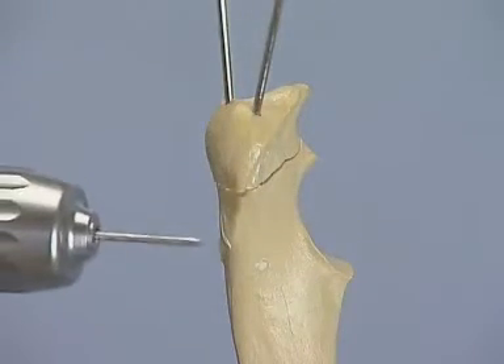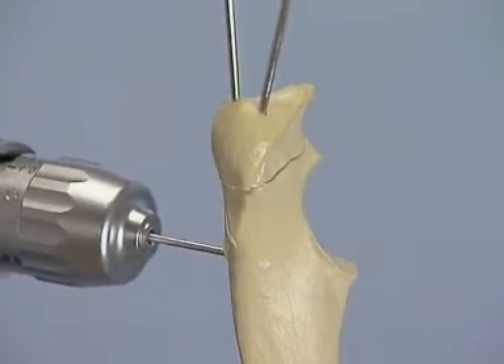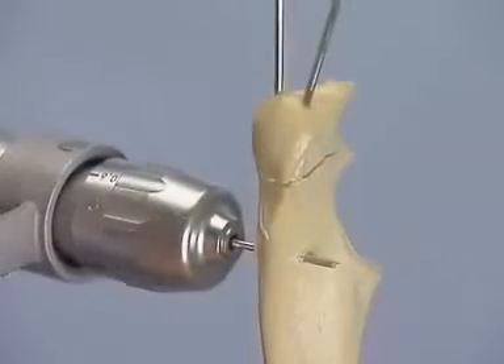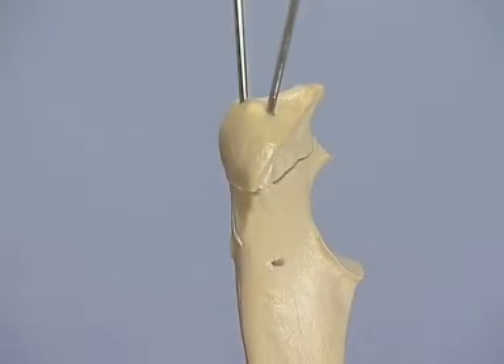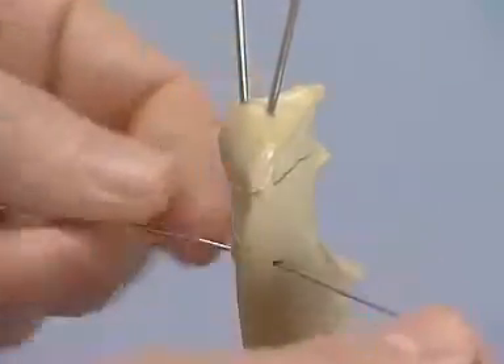With a K-wire, drill a transverse hole in the distal fragment approximately 1.5 cm distal to the fracture site. Cut 15 to 20 cm of cerclage wire from the coil, then pass 10 to 12 cm through the transverse hole.